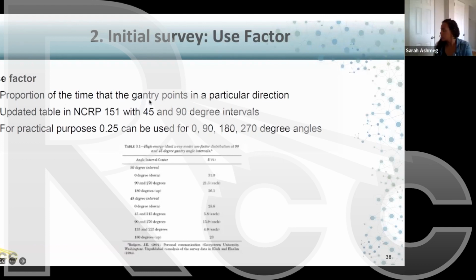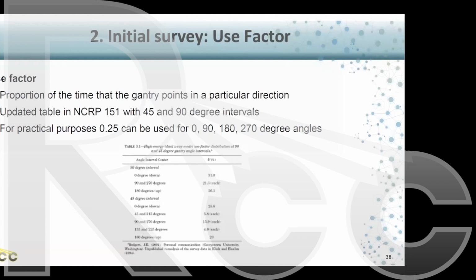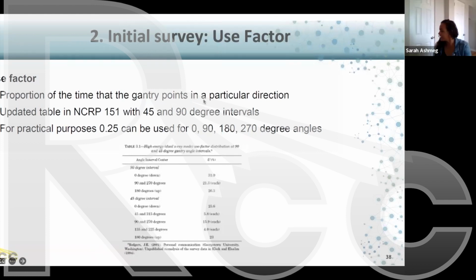Okay. Someone is asking about the decommissioning process of a 15 MV Linac. You need to pay attention to building materials in the Linac head. I'm in the process of decommissioning a Linac. I haven't done it yet, but my understanding is all we need to do is survey the room prior to the removal of the Linac, and then you just survey afterwards. Ideally, you shouldn't measure any radiation. So to the best of my knowledge, that's it. Okay, that sounds good. Many thanks to you.